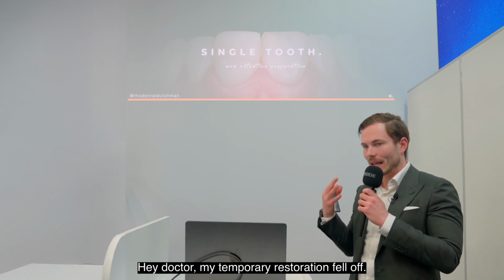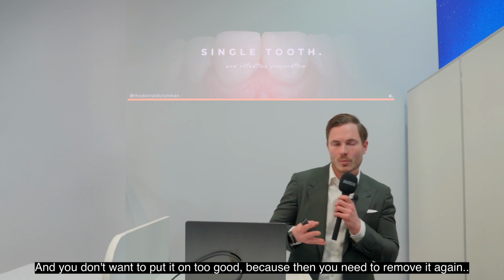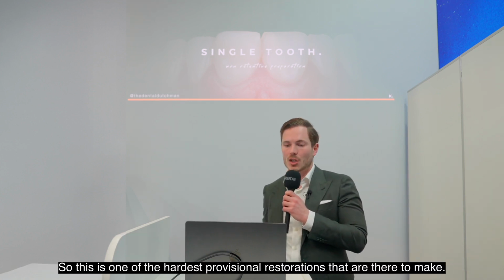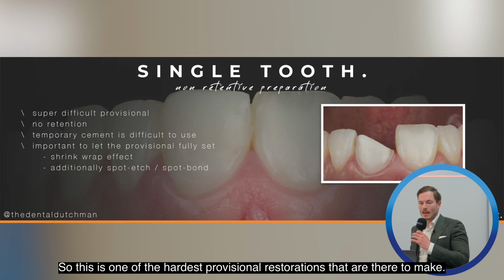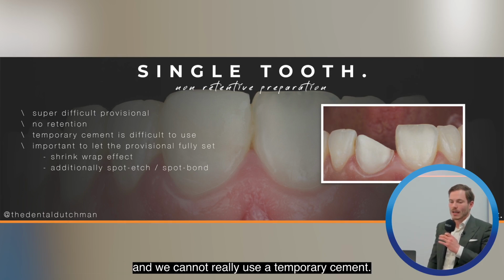Hey doctor, my temporary restoration fell off. And you don't want to put it on too good, because then you need to remove it again and maybe you need to drill it off. So this is one of the hardest provisional restorations that are there to make. We don't have that much retention that we can rely on.